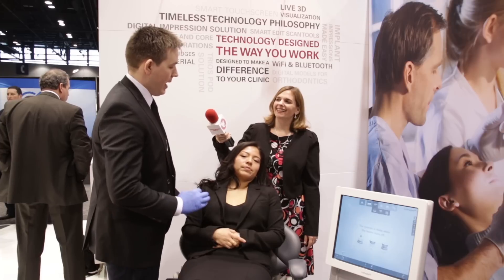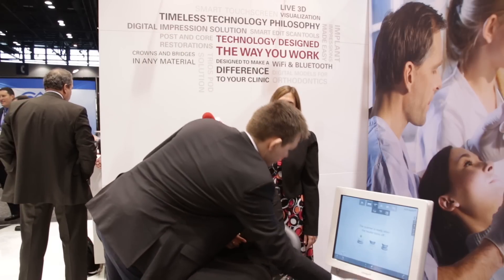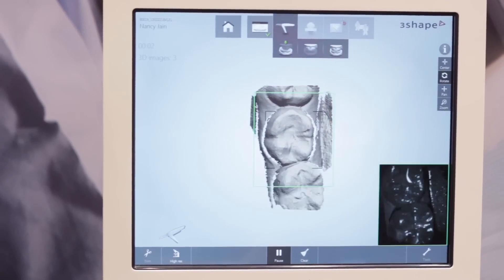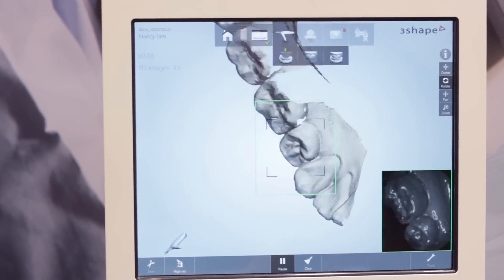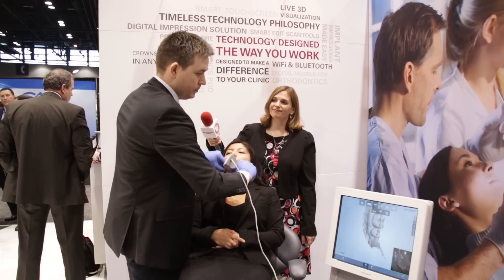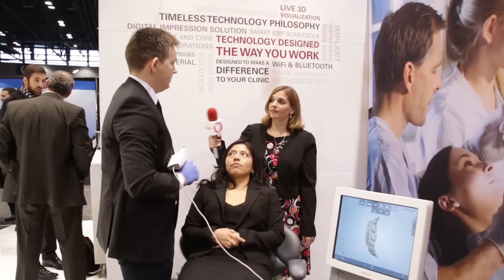I'm just going to do a quick scan of lower, upper, and bite in a small quadrant, like we would for a single crown. It's snapping really fast, and as soon as I scan the lingual aspect here we will get rid of all the tongue tissue. Now I'm going buccal — you can see how fast it goes. I'll angle it a little more to get a new angle on the tissue, and then we are done with the lower jaw, completed in approximately 20 seconds.